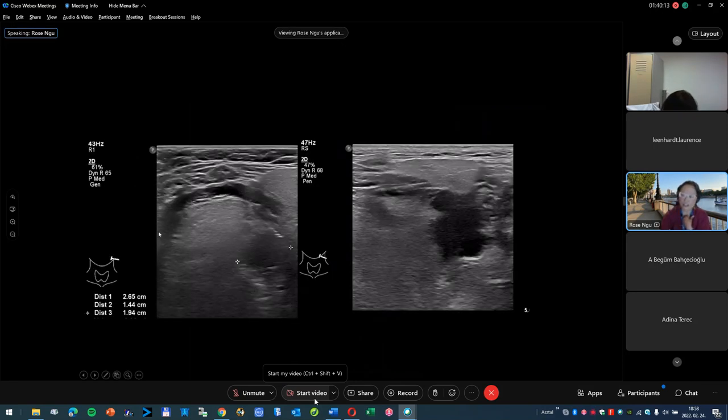And here you could see we are at the submandibular gland, the mylohyoid. This is the tongue. But I'm now looking more towards the level 2 region. So I'm looking at this. So here we know it's the tongue. So we think there is a lesion at the base of the tongue.